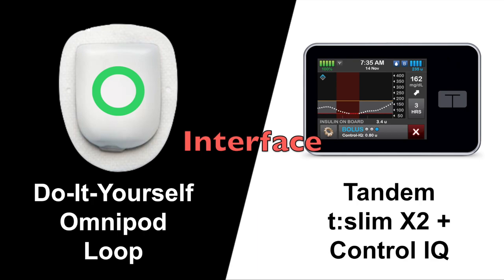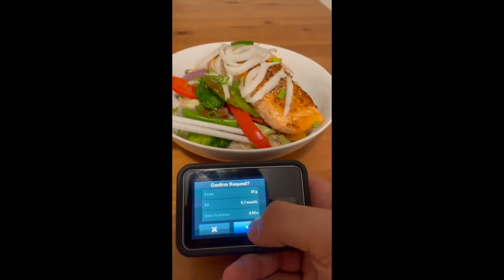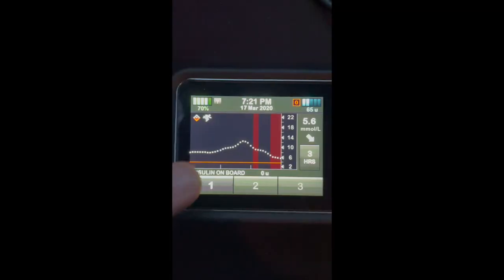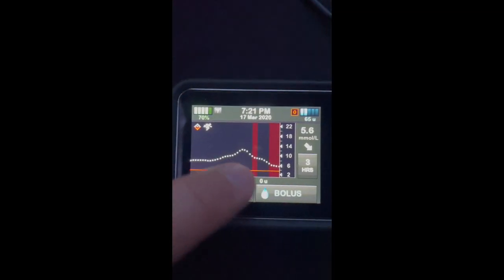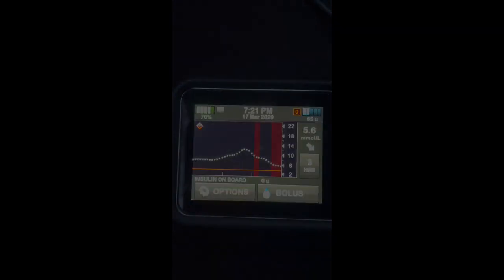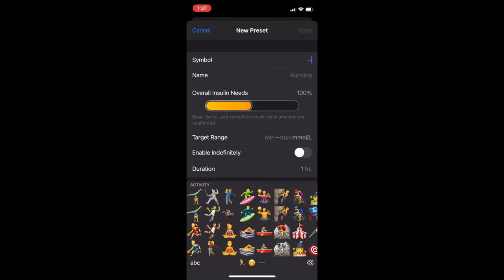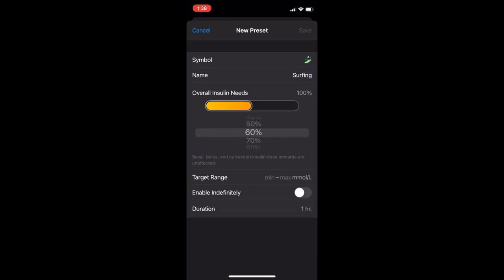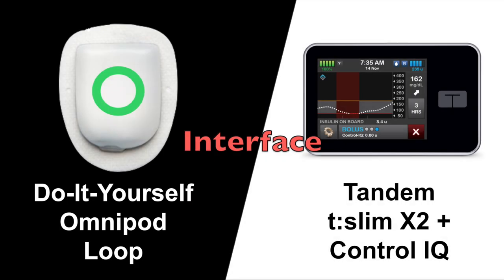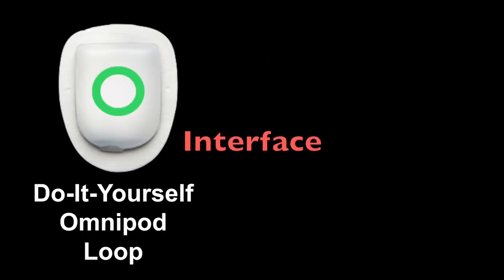Next, I'll be comparing the user interface. Both systems use a touchscreen to enter boluses and adjust your settings. The Loop app is on your iPhone, and I think overall it feels more intuitive than the T-Slim. One thing I quickly noted with the T-Slim is that you can't set a duration for exercise mode — you have to remember to go in and manually turn it off after you're done exercising. The Loop app has a feature called Temporary Overrides, where you can program different situations that may affect insulin needs and set a duration so you don't need to remember to turn them off. The T-Slim has a good UI, but there are a few things that could make the software more user-friendly. The pump is updatable, so perhaps Tandem will make improvements in the future. The Loop app is really customizable and easy to use, and for that reason, I think Omnipod Loop wins this category.